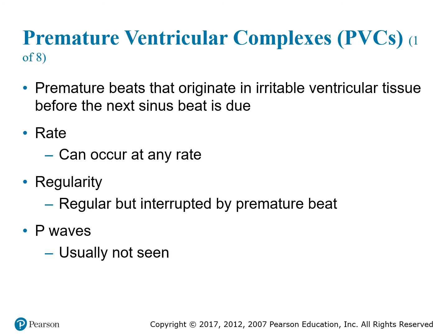The QRS is wide, greater than 0.12 seconds, and the morphology is different from the QRS complex of the underlying rhythm. The ST segment and T wave slope in the opposite direction from the main QRS deflection. If the ectopic QRS complex is predominantly negative, the ST segment is usually elevated and the T wave positive.